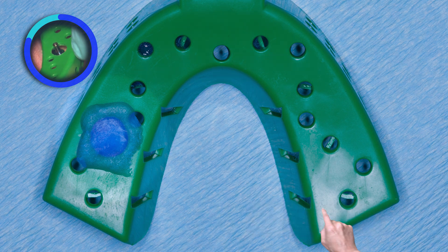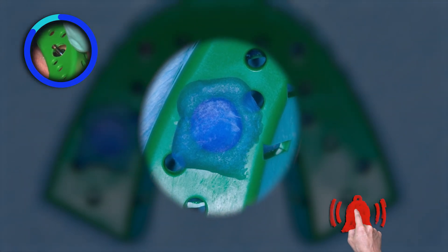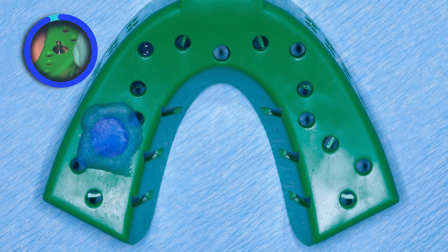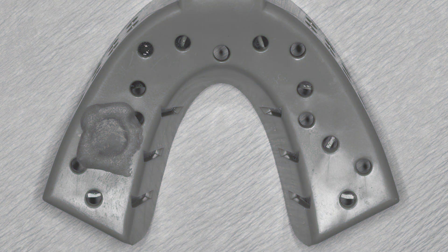After verification, I like to add a piece of blue wax over the top of the hole to help hold the impression material in place. This wax makes locating the top of the coping much easier.